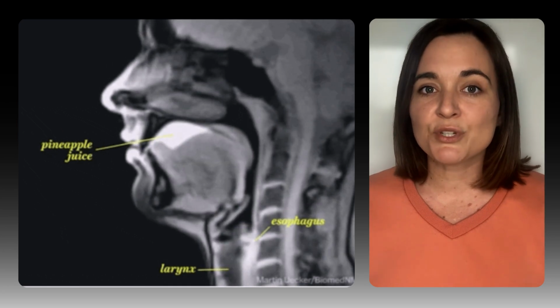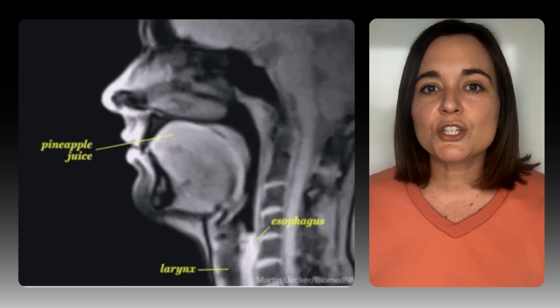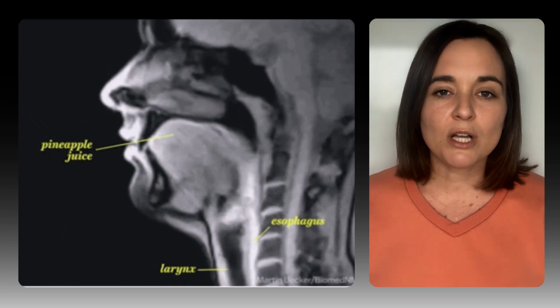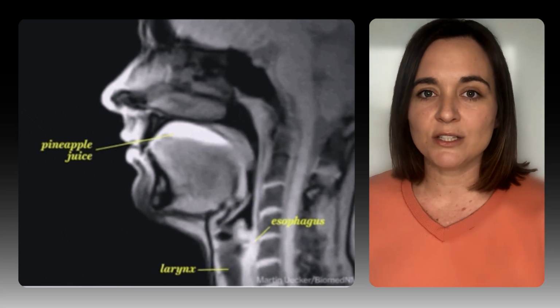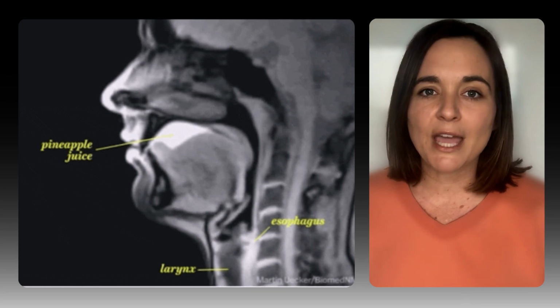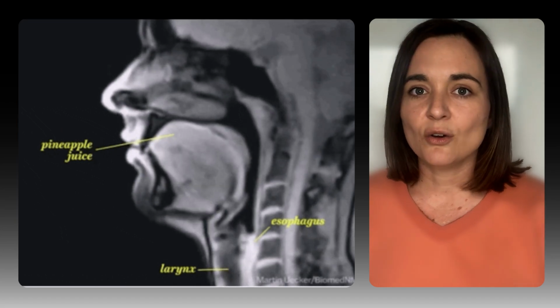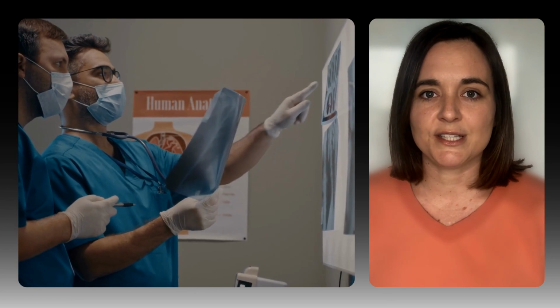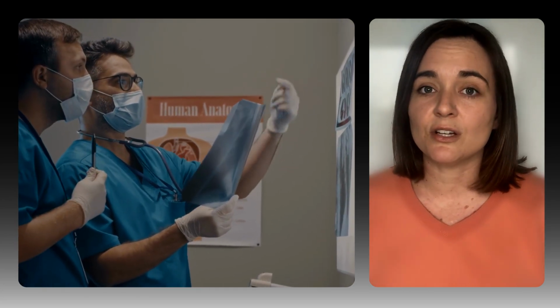What makes these procedures unique is how dynamic they are. We're not just snapping pictures, we're watching swallowing happen. We're following contrast as it winds through loops of bowel, and we're capturing abnormalities as they shift, reflux, or get stuck. These procedures are workhorses in diagnosing conditions like dysphagia, hiatal hernias, ulcers, obstructions, polyps, and even cancer.